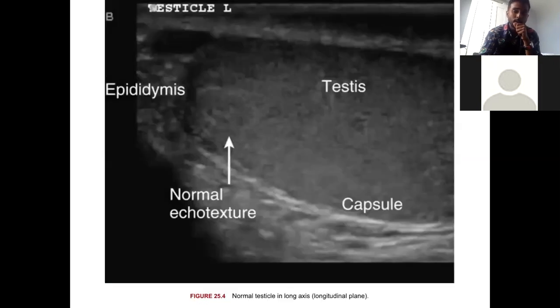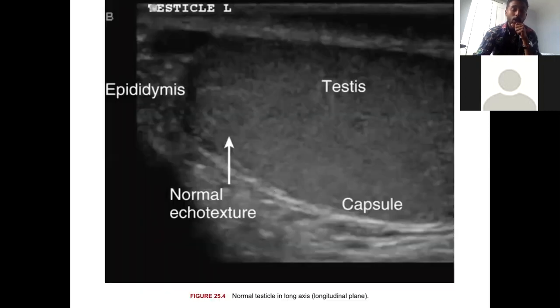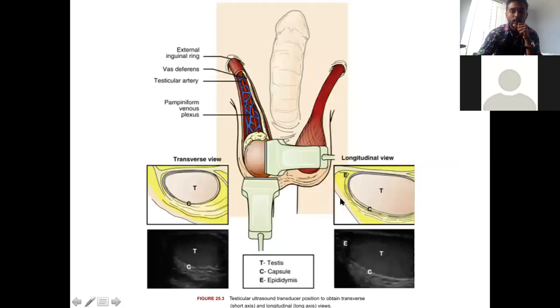All right. So the epididymis, normally it shows posterior and kind of lateral to the testes. It has a superior portion, which is the head, and this is the tail. The superior portion on an ultrasound kind of looks like a pyramid. On a long axis view, you can mostly see the epididymis only on the top. But on a short axis view, sometimes you can see it on the posterior side, because it's behind here, you get what I'm saying, right, Kenny?